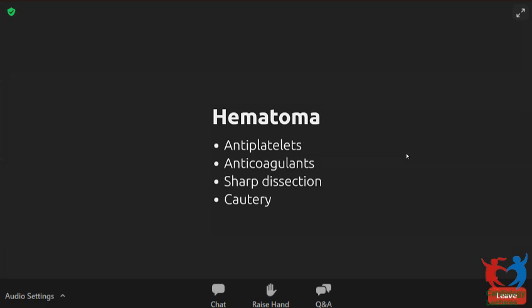Now, in addition, on the third day when you're discharging the patient, you can check the leads. There it is primarily to look for lead dislodgement. If you've got either macro dislodgement or micro dislodgement with threshold rise, you'll be able to identify. So ideal is to check it. So you should probably check that.